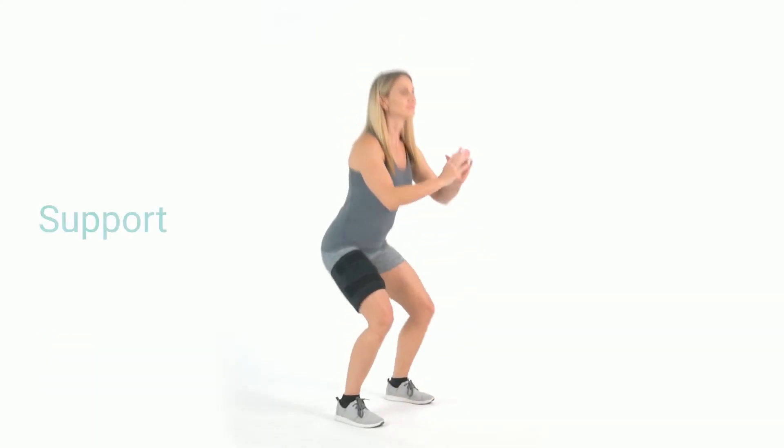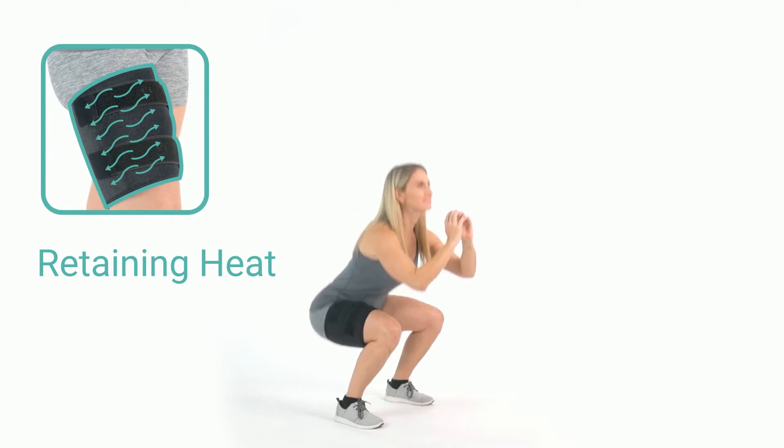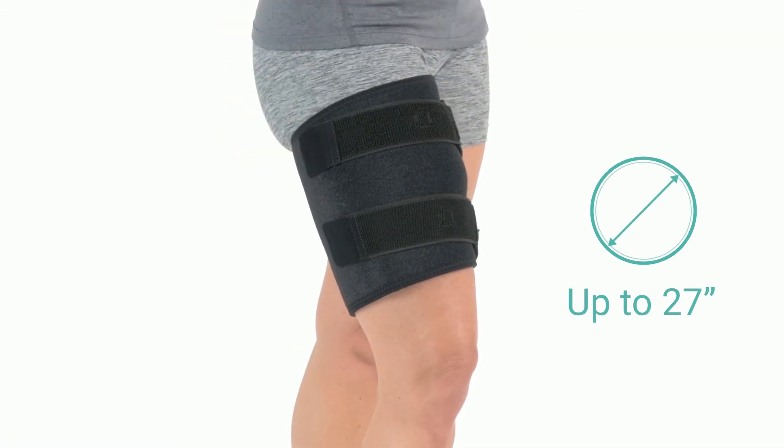Lightweight neoprene provides support and freedom of movement while increasing circulation and retaining therapeutic heat. Adjustable elastic straps with strong fasteners fit thighs up to 27 inches in circumference.